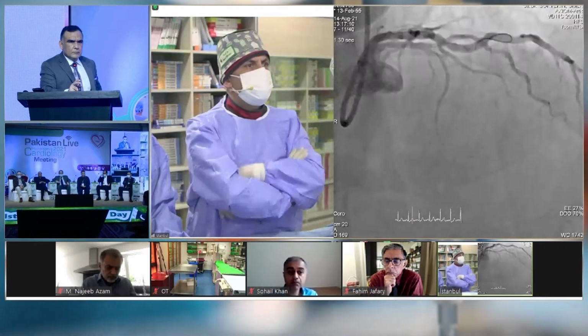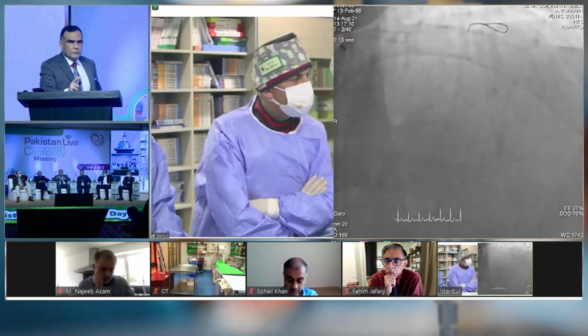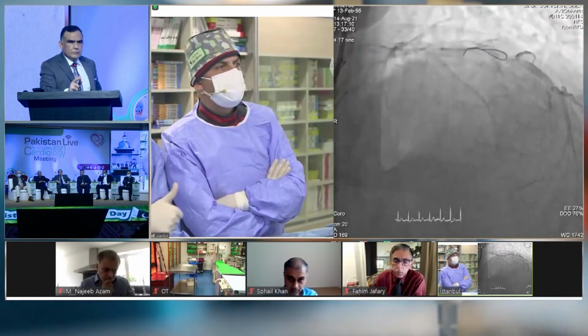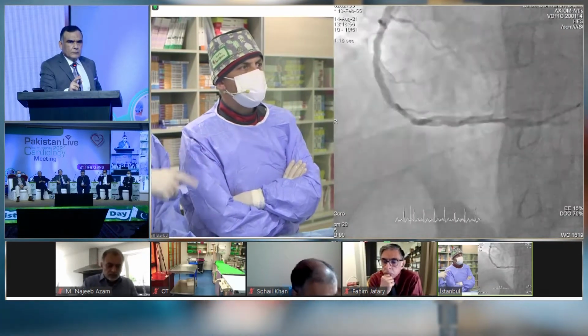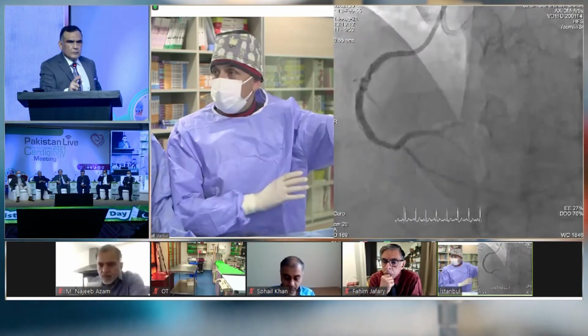Very nice collateral. Next, please. And now we have some right injection to see the right system, and I'd like to see it.